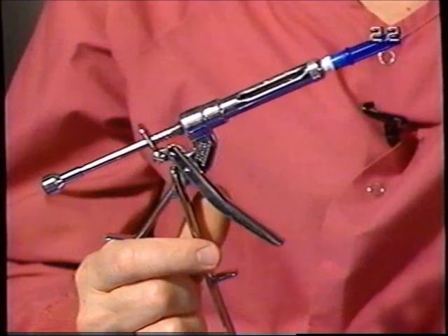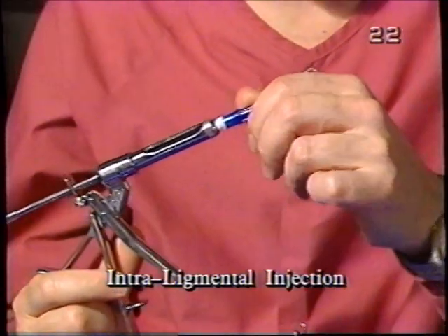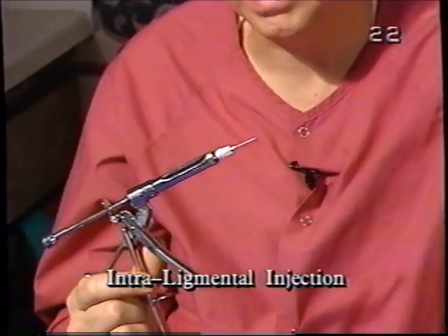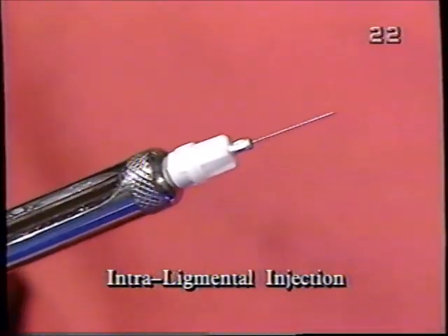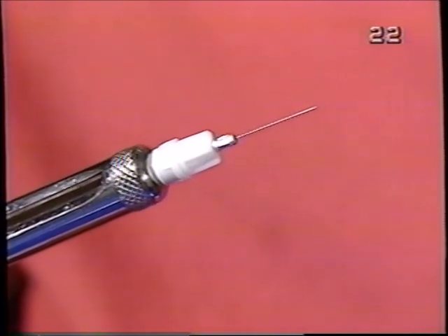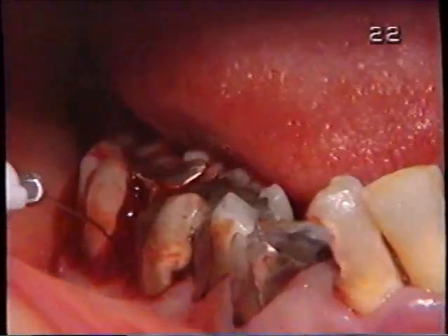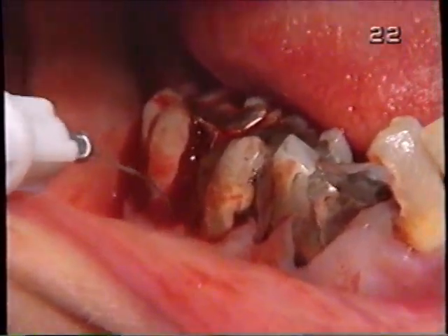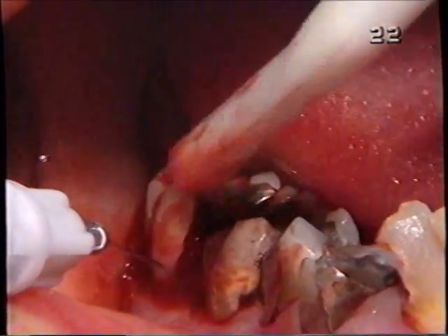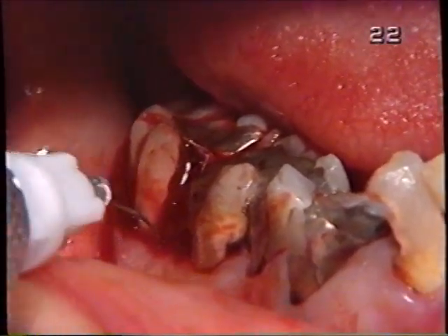We do use the interligamental quite a bit. It has a 30-gauge needle, 1 inch, but I engage this into the periodontal ligament space, one for each root that the tooth may have, give it maybe 10 or 15 seconds of solid back pressure without backflow in those areas, and then we usually are able to go right ahead without having to wait to reblock.